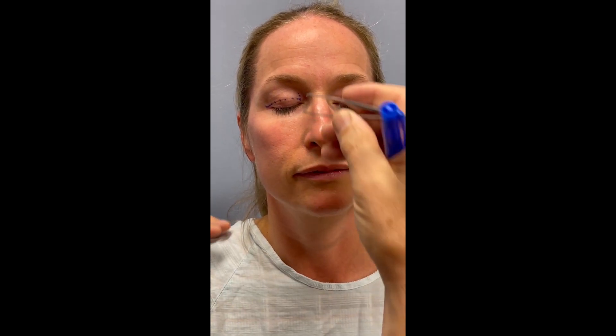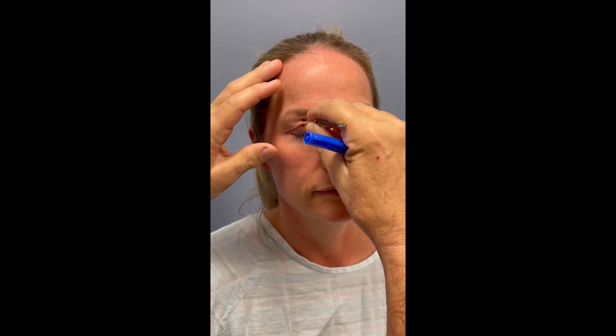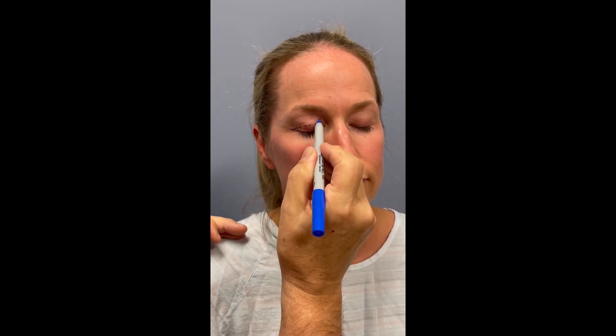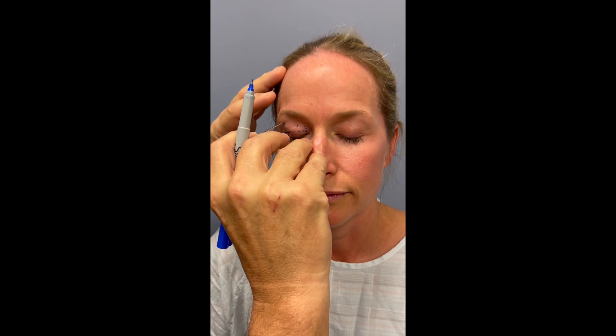Once the lower line is made, we use a device called a fixation forcep to gather up the extra skin, to be sure we don't take so much that causes the eye to remain open after the case. We want them to have normal eyelid closure. Checking it on the side — that's good.